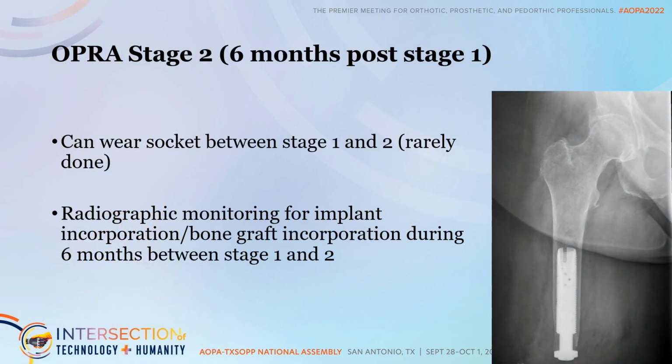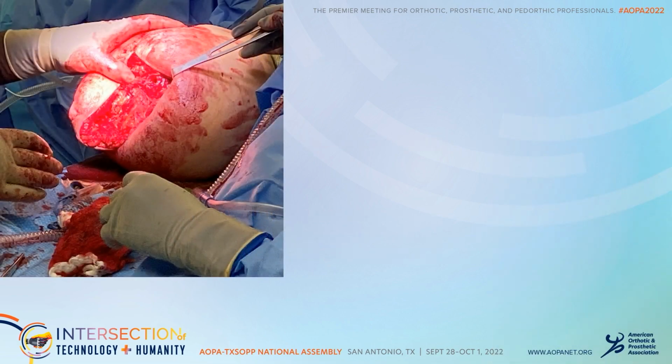During that time, patients can wear a socket. However, due to various issues, one is insurance, patients rarely wear sockets in between that time. We do perform routine radiographic evaluation to ensure that the implant is successfully osseointegrated before moving on to stage 2.